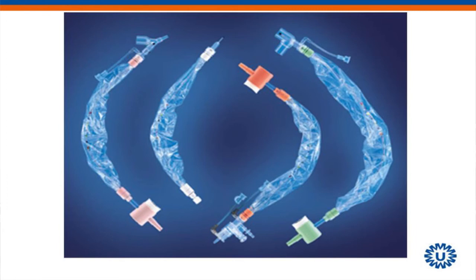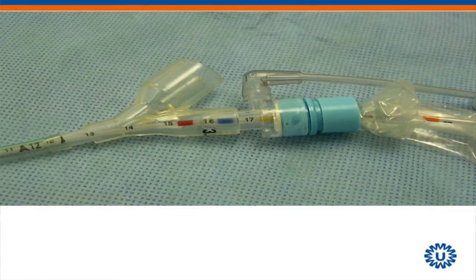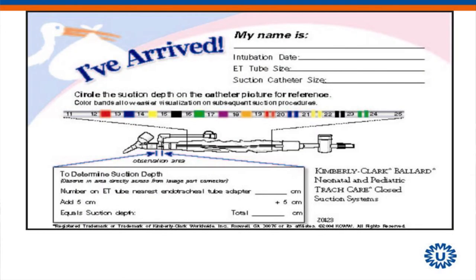And these are the closed suctioning systems. Everybody is using some kind of closed suctioning system, so I think you all know how they work. Yeah? Okay. What you see here, in the connection with the endotracheal tube, here the place to put your ventilator circuit, and here a line. Where do you use this line for? To putting in some saline? Yeah. And what do you use the saline for?